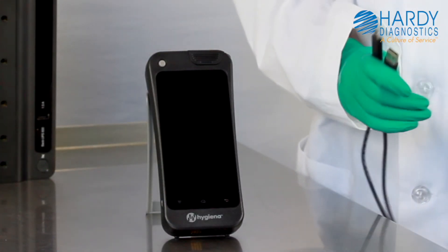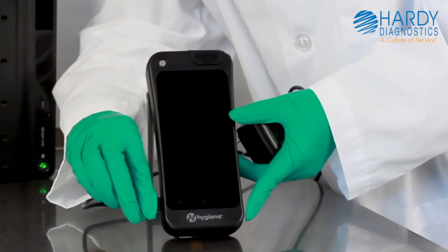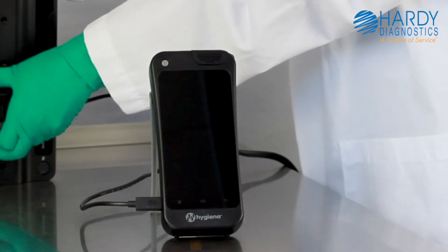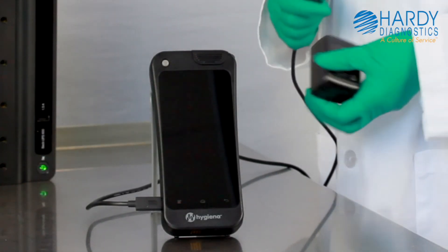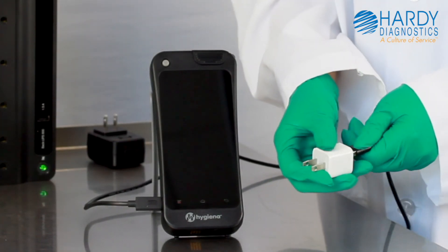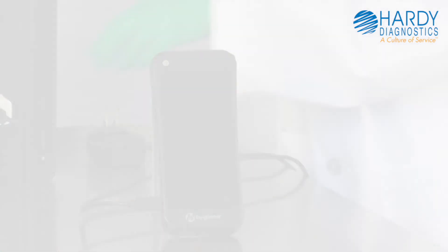Troubleshooting. If you followed the previous steps and you're still having trouble, take a moment to confirm that the cable and wall adapter you're using function correctly. To troubleshoot if the wall adapter is working properly, try plugging the USB-C cable into another wall adapter such as the one you used for your iPhone or Samsung smartphone.